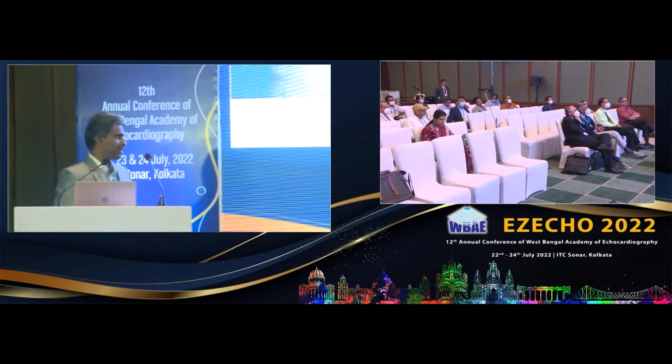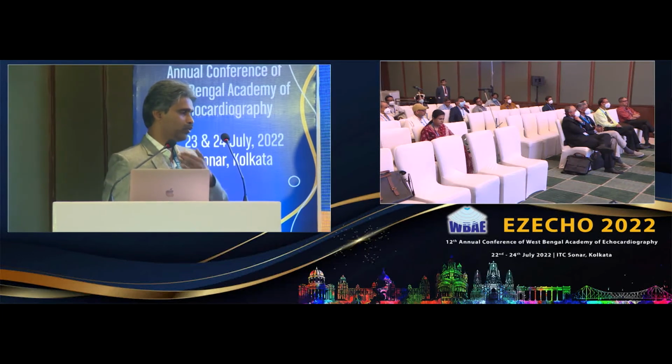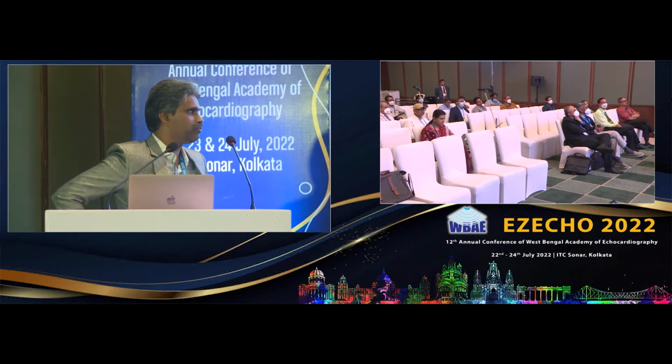Whatever, we can do the scan here and upload the data to the HeartFlow team, and they will do the post-processing and send it back. So we don't have an in-house post-processing tool. Still, it is the HeartFlow team now which is doing that.